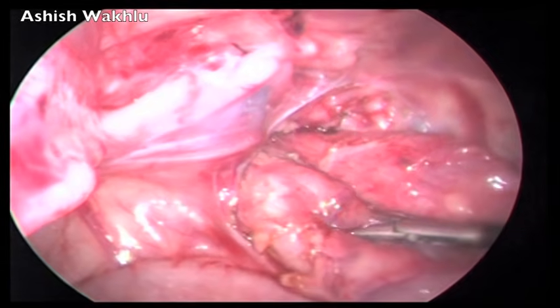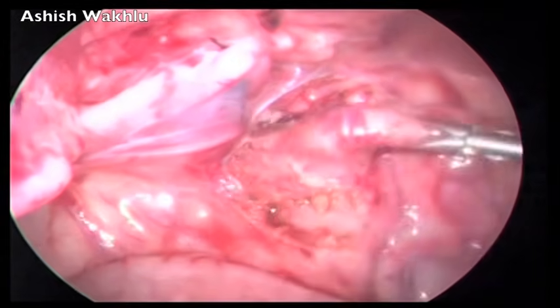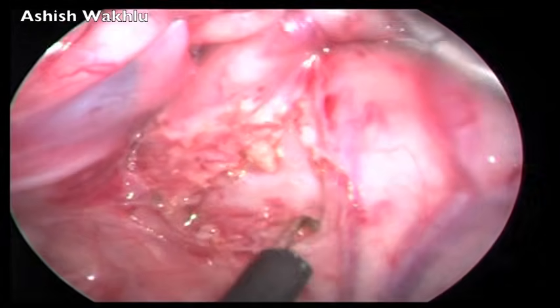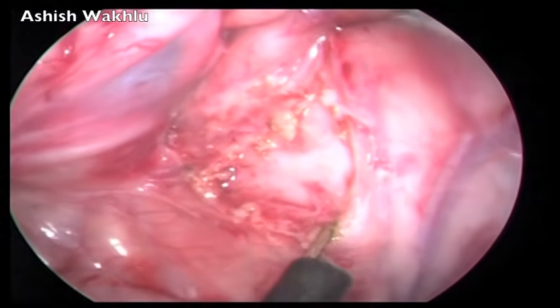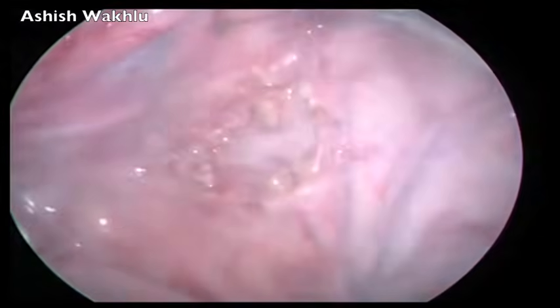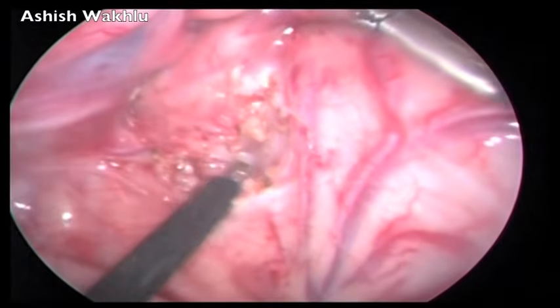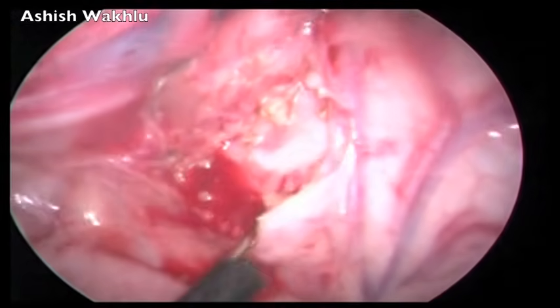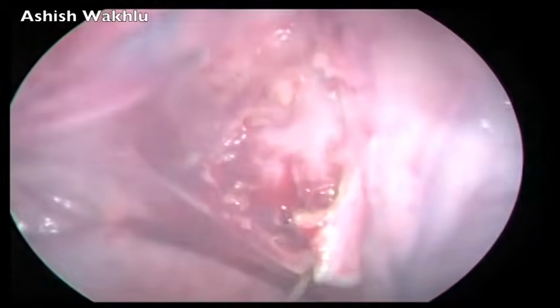It is a common observation in surgery for anorectal malformations that if a colostomy is incorrectly performed, as in this case, there is a lot of dilatation of the distal bowel because the mucus which is secreted in the distal loop does not get a chance to get out of the colostomy.